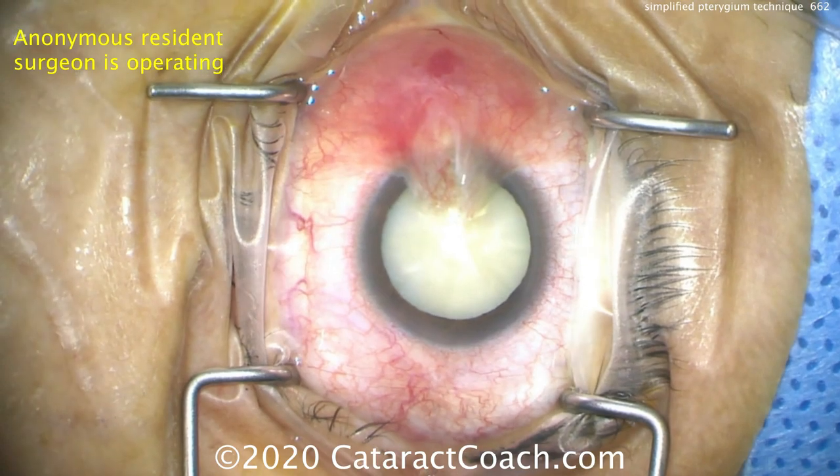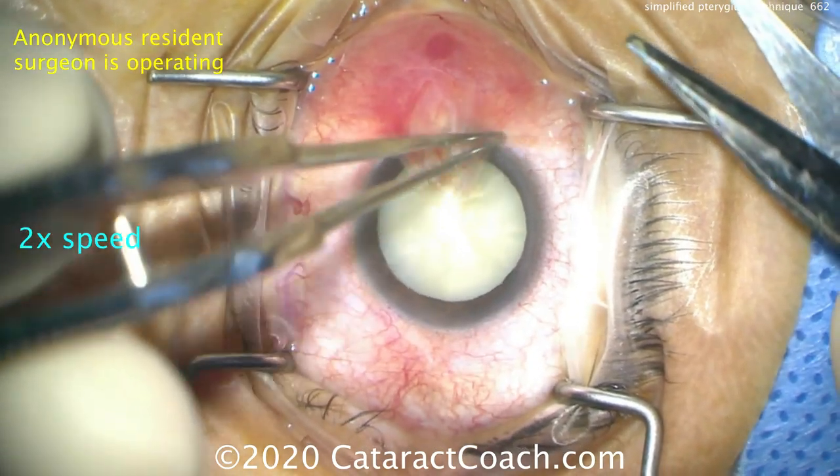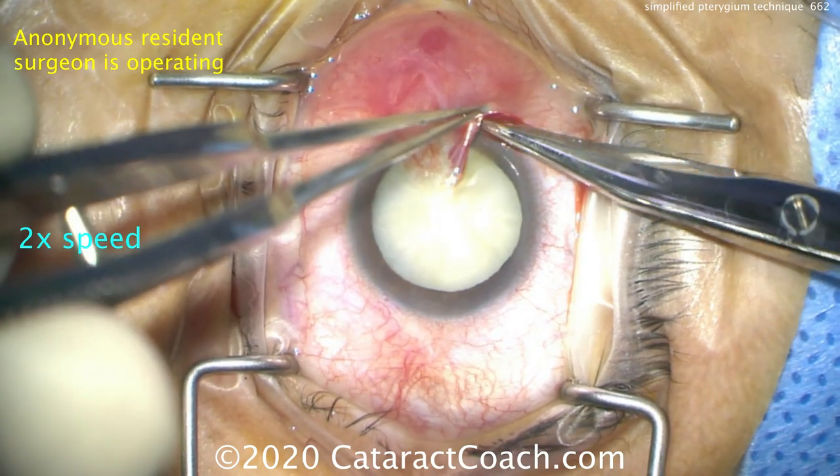Ten minutes ago, we injected lidocaine with epinephrine 1 to 100,000 in the pterygium to puff it up, to help separate it, and also to give anesthesia plus help achieve hemostasis.